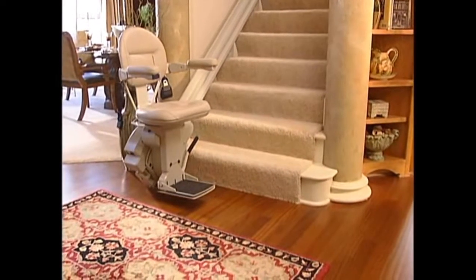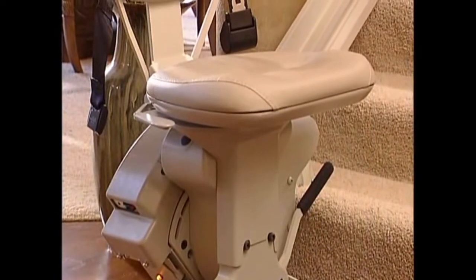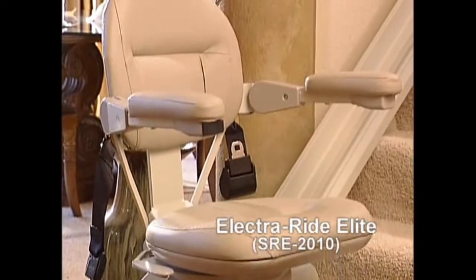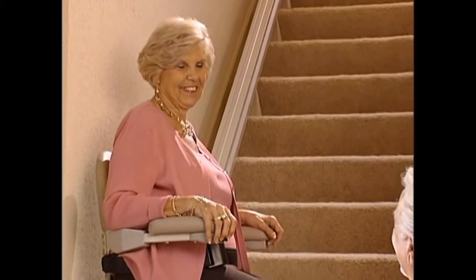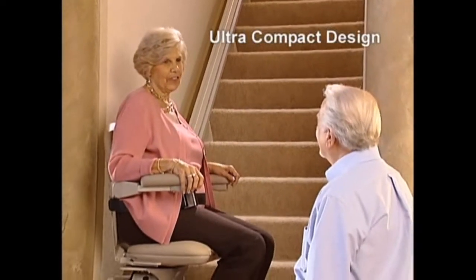Superior styling, outstanding craftsmanship, rugged reliability. Those are the earmarks of the new ElectraRide Elite model SRE2010. Representing more than a decade of research and engineering, this beautiful straight rail stairlift offers the finest in streamlined ultra-compact design.